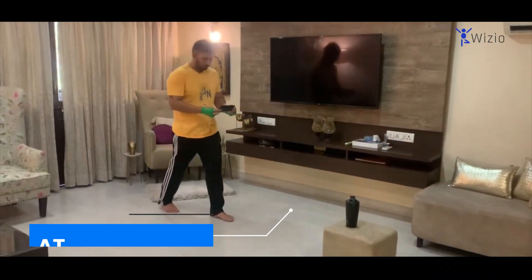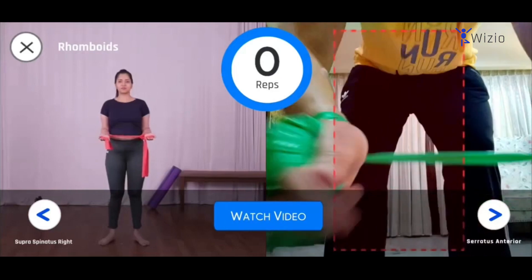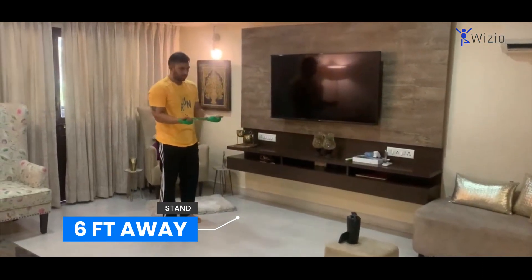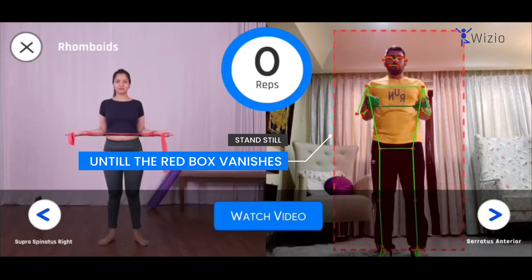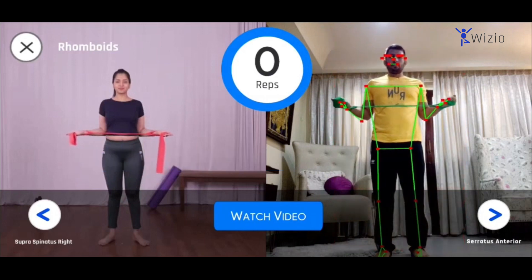Keep the phone on a chair or a stool at about three feet height. Orient your position and stand roughly six feet away from it, and stand inside the red box. Stand still until the red box vanishes from the screen, then start your exercise. Hold for 10 seconds and then release gradually.